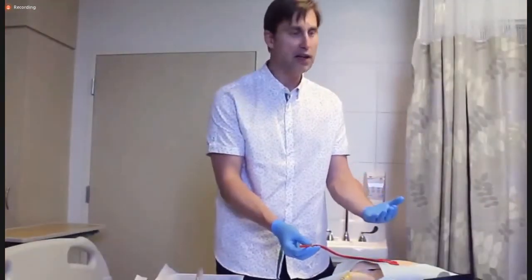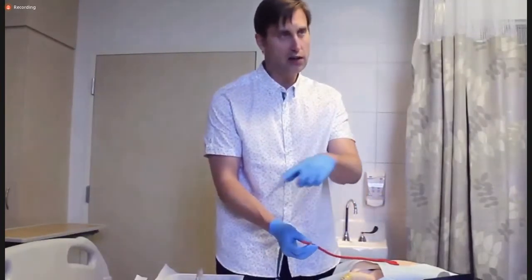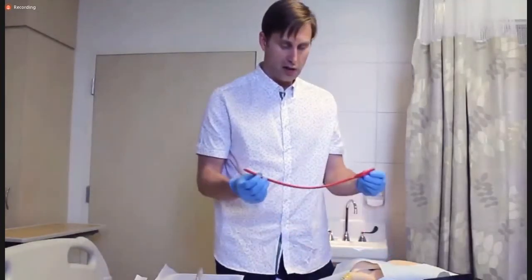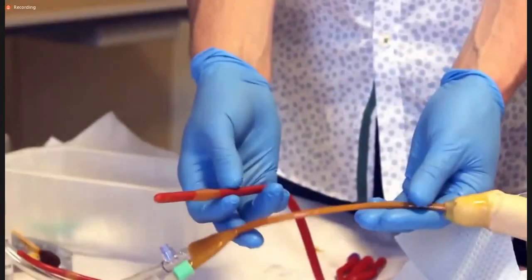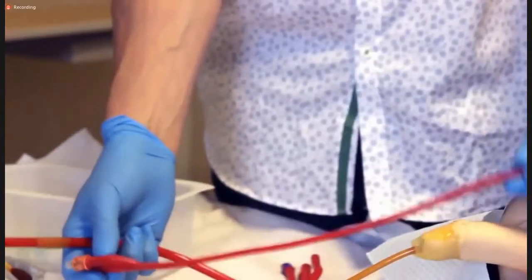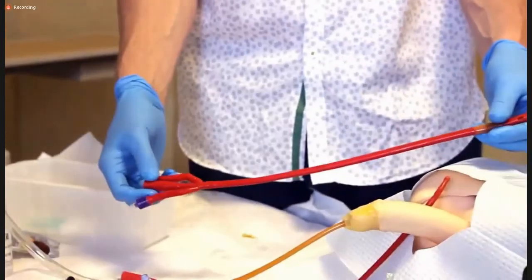So this is the kind of catheter that we put into the bladder to irrigate blood clots out and then to irrigate saline or other fluids into the bladder to prevent those clots from reforming. So these catheters, as you might expect, are a little bit bigger than the regular catheter. So in this case, this is a 14 French. In this case, it's a 16 French coude. In this case, it's a 22 French, but three-way Foley catheter.